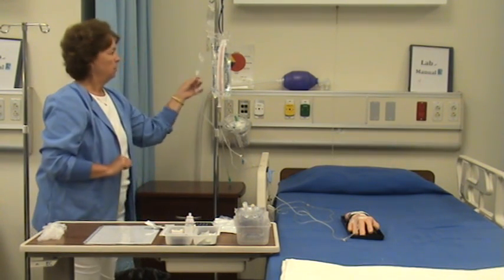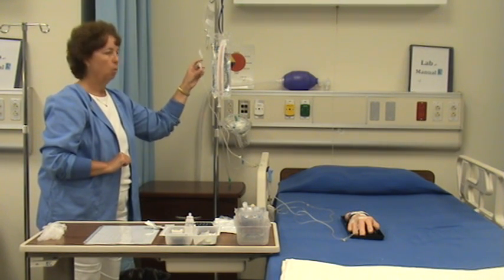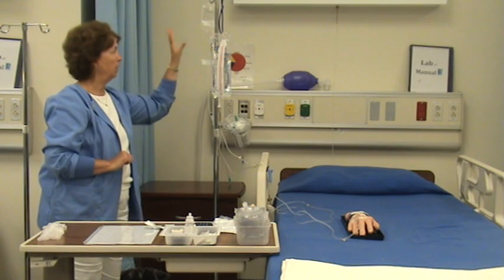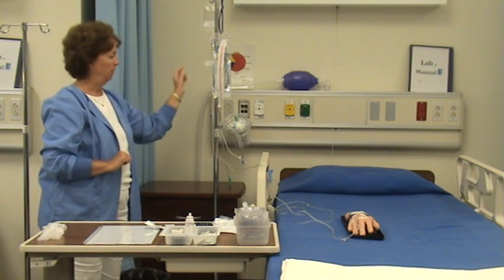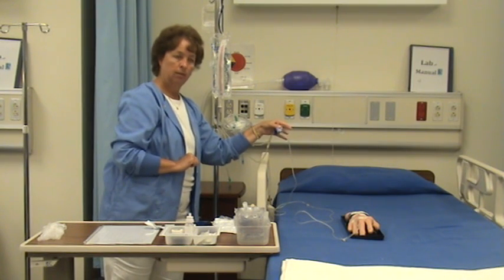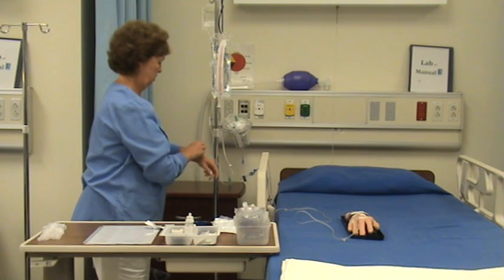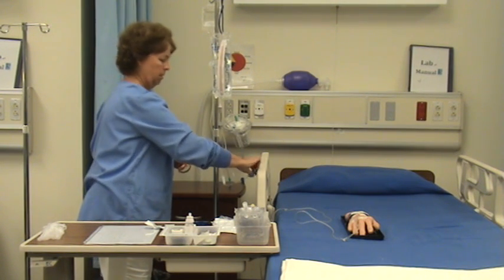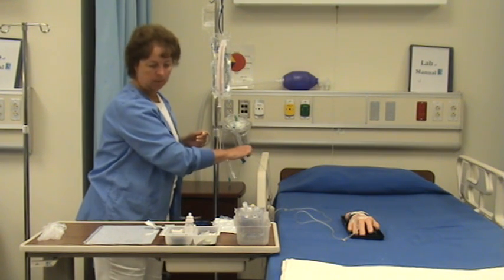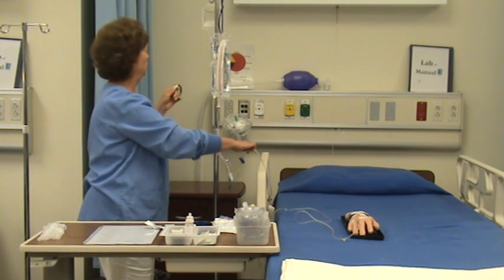So what I'm going to do, the roller clamp to the secondary IV piggyback, this is important, just open it all the way. You're not going to regulate this IV with this roller clamp. You're going to regulate it with this one. So now I'm going to set my drops per minute at approximately 8 every 15 seconds, or 32, 33 per minute.